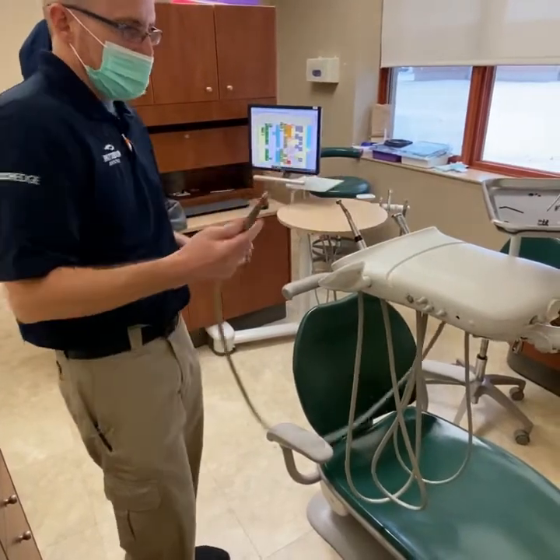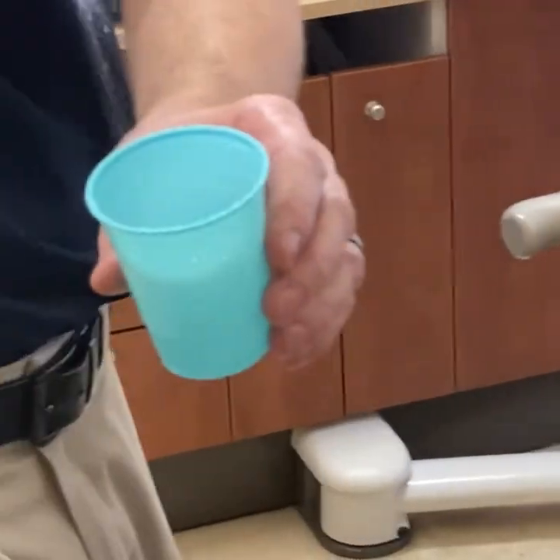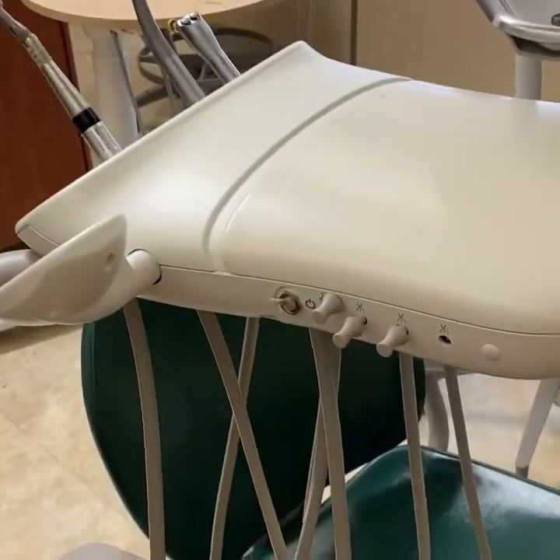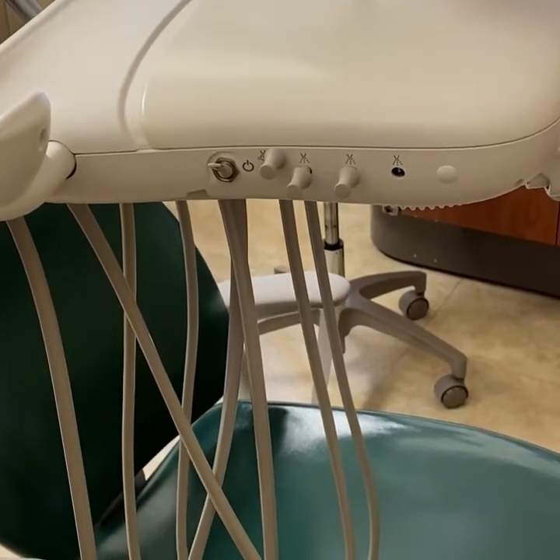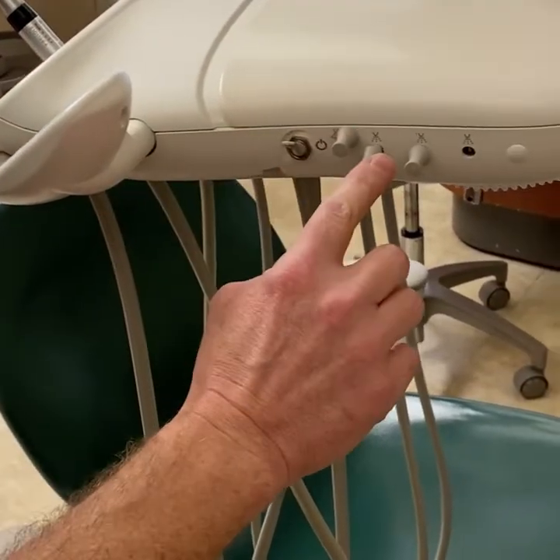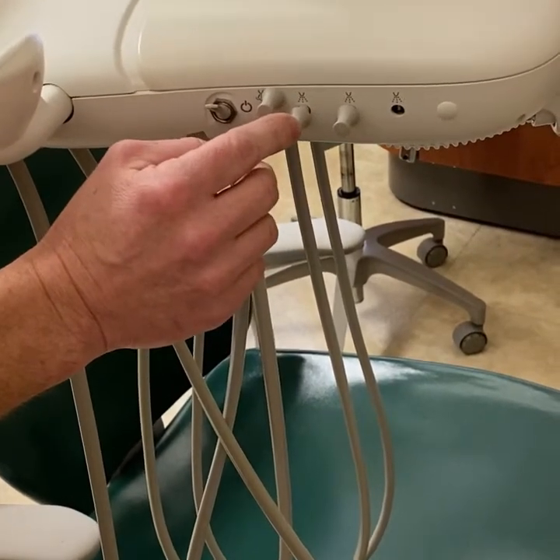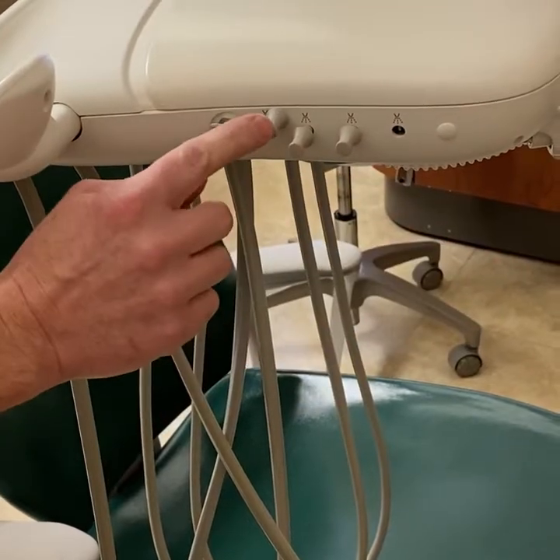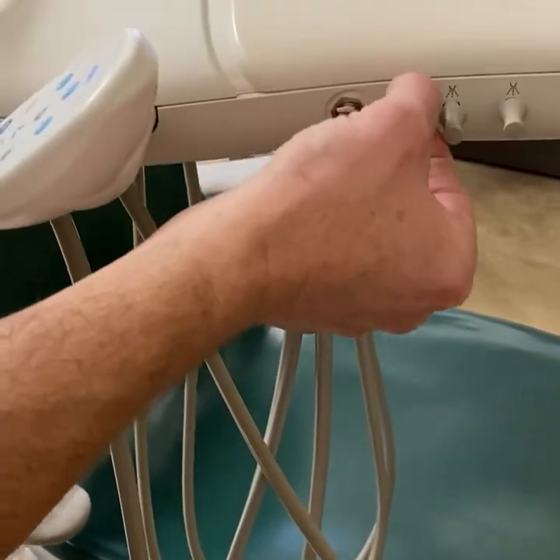Next I'm going to show you how to adjust the water and coolant air on your high-speed handpiece. This one is getting a ton of water and not that nice cloud we like. All units are a little different, but somewhere on the side or back you should have adjustment knobs. You count positions from left to right — syringe, then positions one, two, three, and four. Our high speed is in position one. This is the water adjustment for position one, this one is for positions two through four, and this one with the cloud icon is your coolant air.